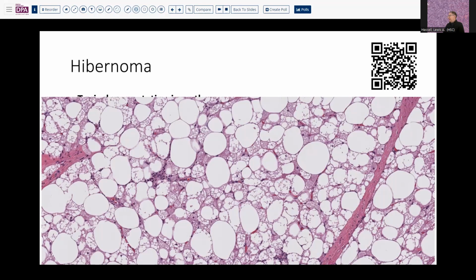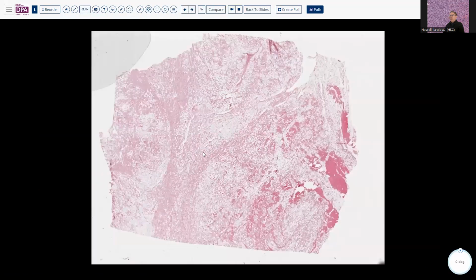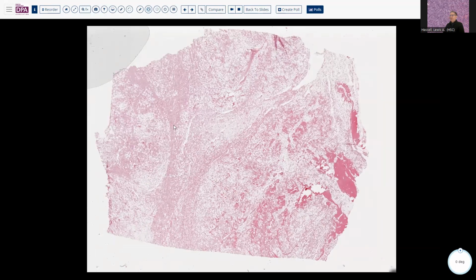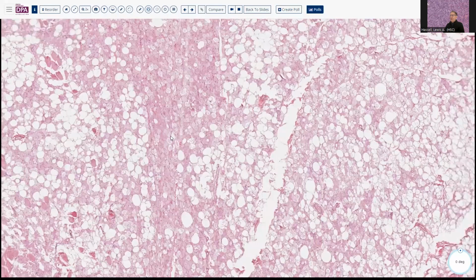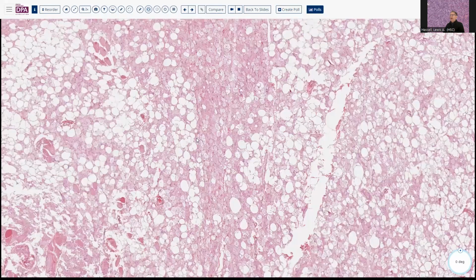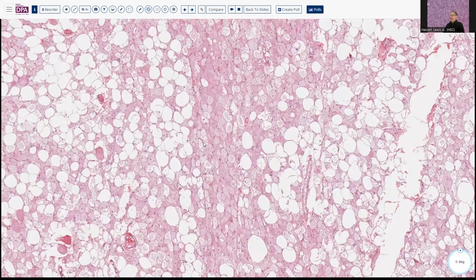There is, interestingly, an 11q13 to 21 rearrangement that may have resulted in deletion of a tumor-related gene, the MEN1 gene. So we have several examples of this lesion just to give you some exposure to the spectrum. As you can see here, fatty tissue, somewhat altered in coloration. And grossly, these usually are a little browner, a little more yellowish brown than the surrounding fatty tissue.